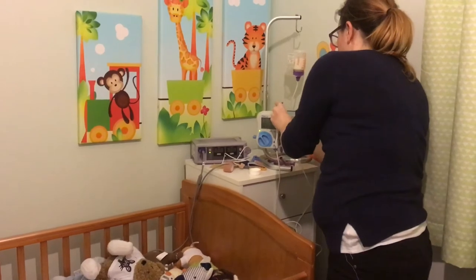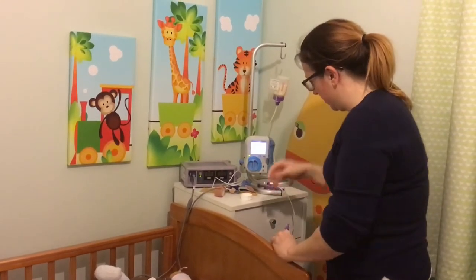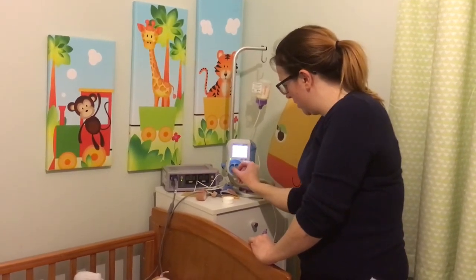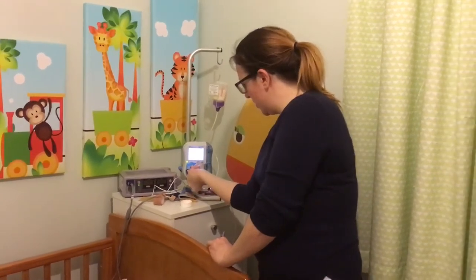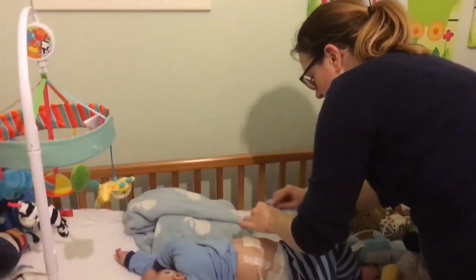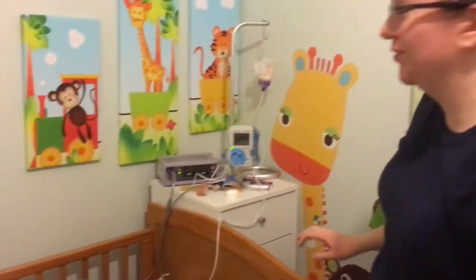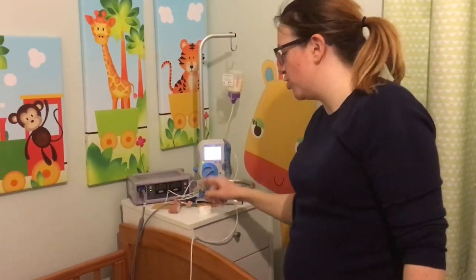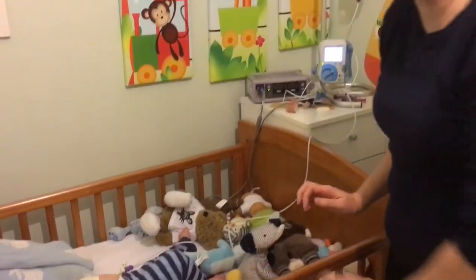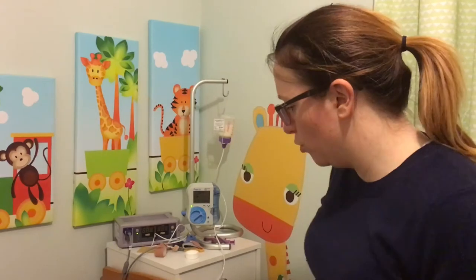And this one attaches in here. So I'm just going to check that it's cleared from last time — which it is. So I'm just going to attach this to his gastrostomy and then just click it onto here and it'll start running. So the milk's starting to just feed down his tube — it drip feeds him. This one's just for a couple of hours and then we'll put another one on later that drip feeds him all the way through the night.